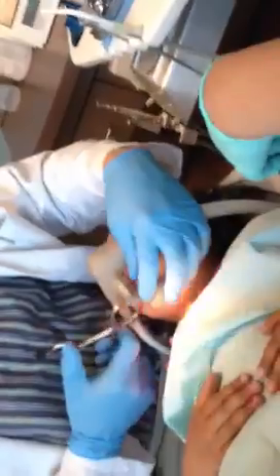All right, we're going to try it in the tooth chair. It's soft and rubbery, and it clicks like popcorn. Open really big — we'll try it on this side.